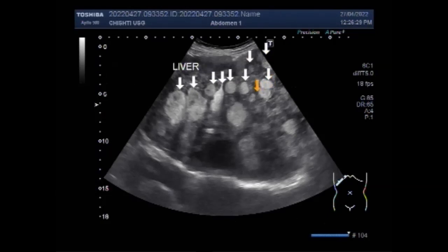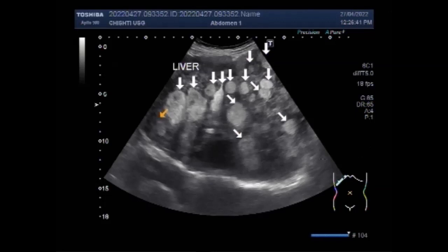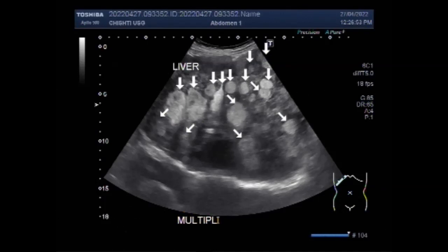You can see the multiple hepatic masses, and these masses are protruding outwards from the surface of the liver, with bulging of the chest cavity on the right side. These masses are round to oval in shape and semi-solid to solid in consistency, and a few of the masses have heterogeneous echogenicity.